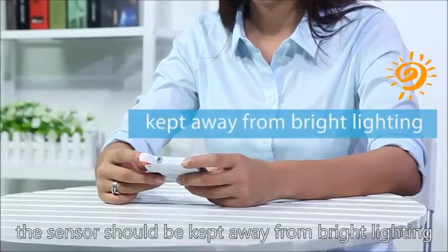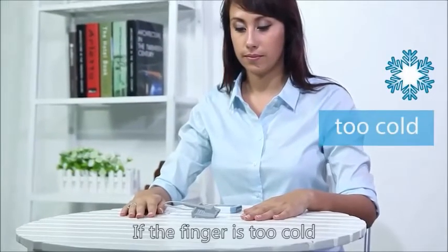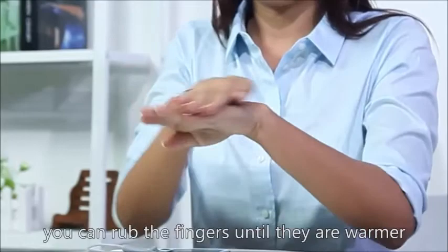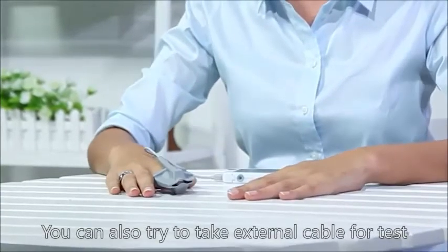When measuring, the sensor should be kept away from bright lighting. If the finger is too cold, the oximeter may not be able to get the SpO2 results. Before testing, you can rub your fingers until they are warmer. You can also try to take an external cable for testing.